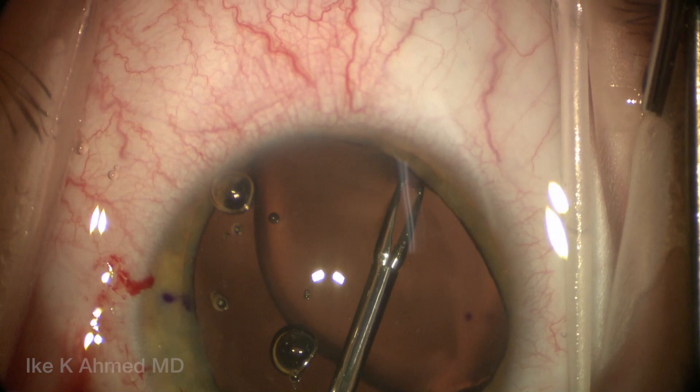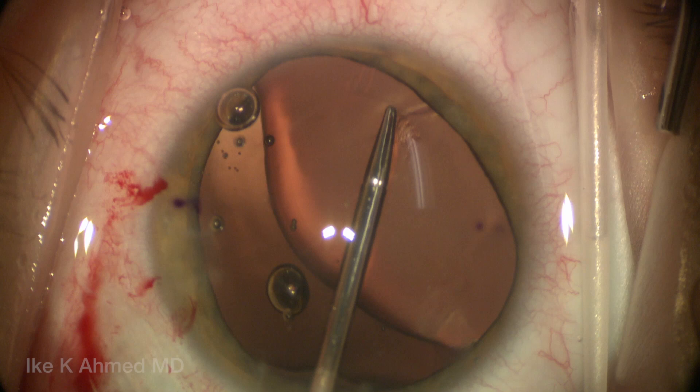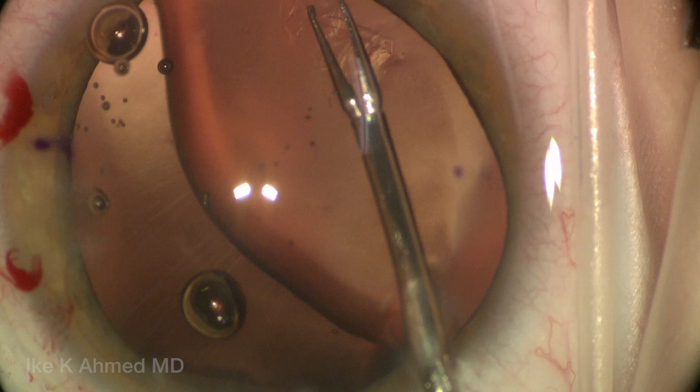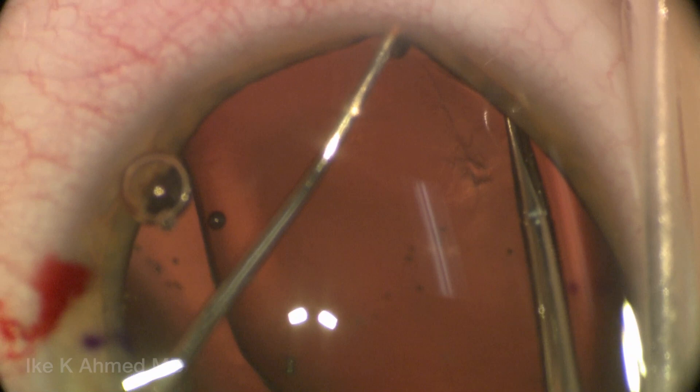A sharp-tipped micrograsper is used to pinch on the capsule in the visual axis. You can see the lens is quite subluxed, and we're going to start this tear. The tear wants to go in a clockwise fashion. What's very important is to create a tear that's relatively centered on the capsule. The crystalline lens complex is hard to see, but we can visualize parts of the capsule, using multiple incisions with our micrograsper for best access and a Kuglen hook in the non-dominant hand to help expose the capsule.